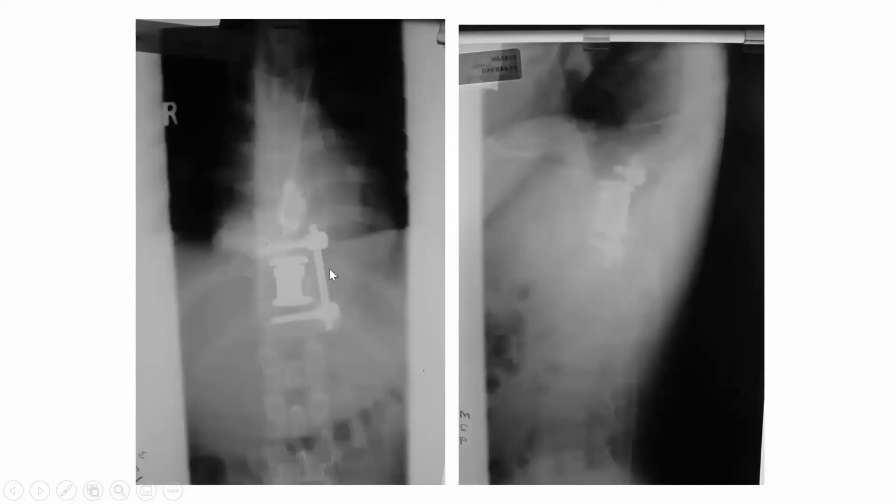In a patient with osteosarcoma, with tumors, we tend to use cages. Now, obviously, you've got a big vertebra taken out here, so you want to use a cage which can expand. This is an expandable end plate cage. You can turn inside and it clicks and opens, so you've got a range of cages. You can do entire vertebral body replacement. You fill this cage with bone graft, and I'll just put some rods and screws to try and stabilize it. That's a typical reconstruction cage, where it's expandable. You get these cages made of PEEK now and all sorts of different materials.